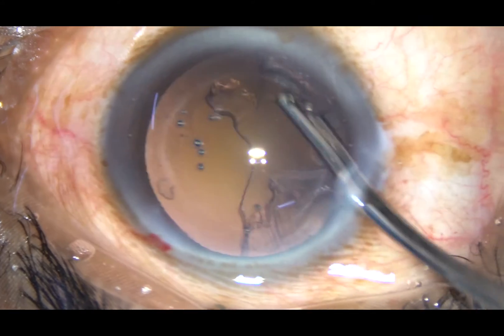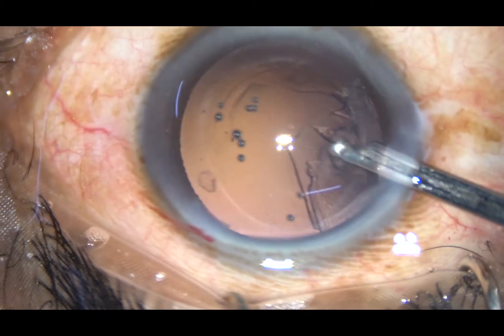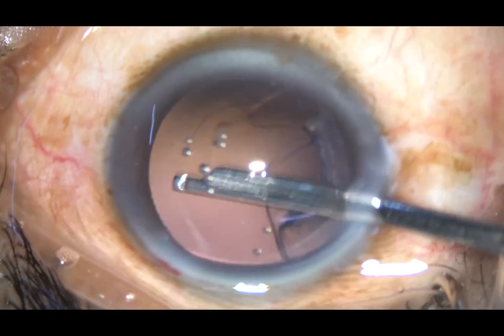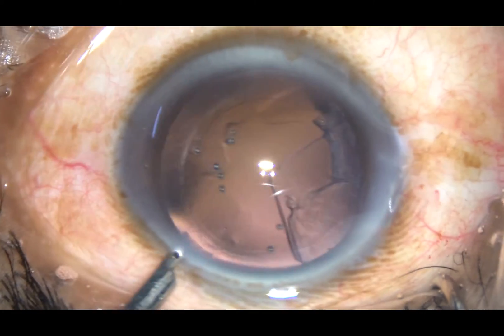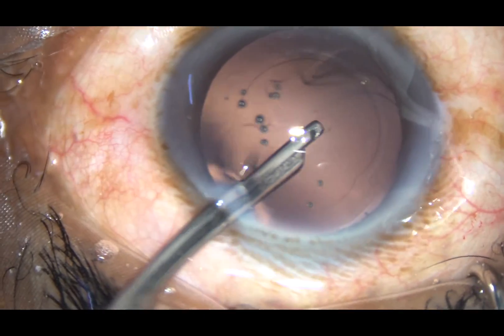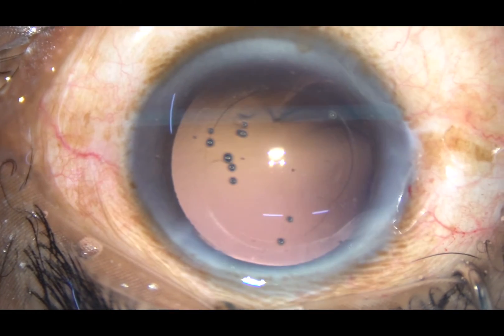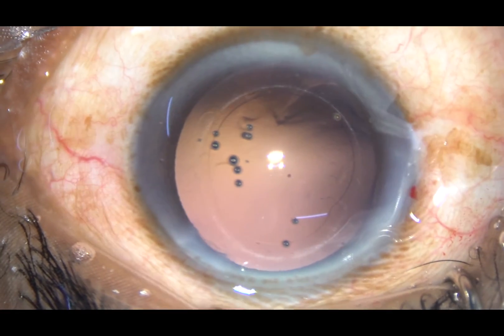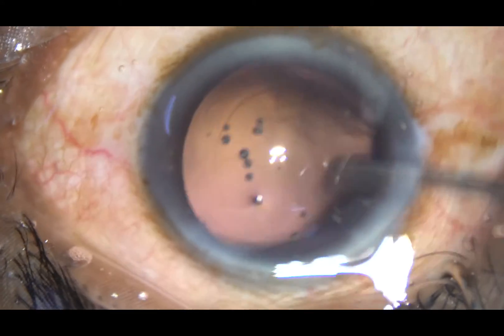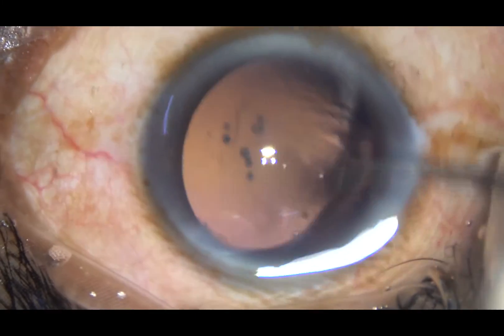Since I have made only one side port, I have decided to use this instrument rather than bimanual irrigation-aspiration. I go through the side port and remove the cortex from 8 o'clock to 11 o'clock. The cortex has been removed. Now some polishing of the posterior capsule is done with an irrigating probe, which dislodges cells sticking to the posterior capsule.